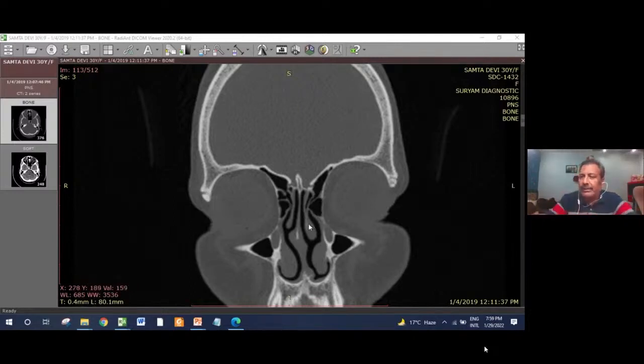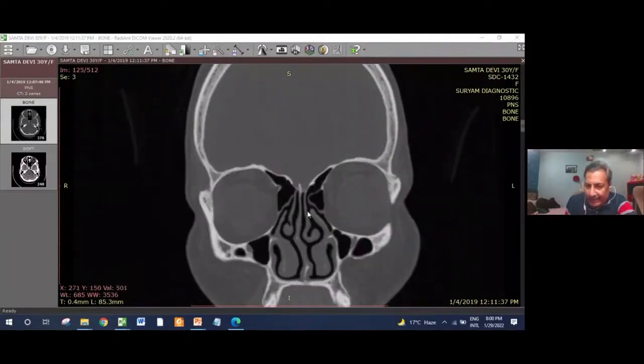Sometimes you need some sort of turbinoplasty for a floppy turbinate, for a concha bullosa pneumatized turbinate, or some thick hypertrophic turbinate to get extra space, and then you can use your sharp instrument, through biting or sharp scissors or whatever, to reduce the turbinate rather than pulling it. Any torsion of the turbinate at this point is hazardous and can lead to a CSF leak. That's why we must know how the turbinate is attached to the upper part of the skull base, particularly the anterior-most part lying in the sagittal plane.